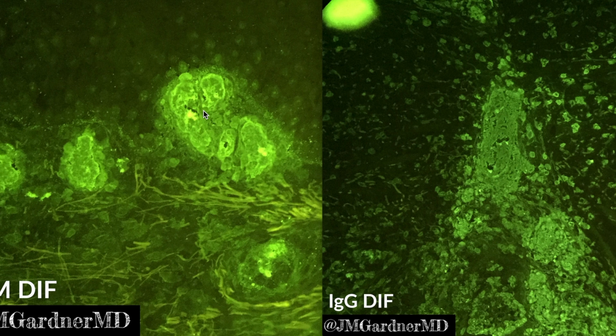But you can see the deposits in the vessel are staining here with IgG and very brightly staining with IgM. And I believe in this case the patient actually had rheumatoid factor in the blood, and so this IgM is IgM with a specificity for IgG. So IgM that's called IgM anti-IgG, that's rheumatoid factor. And so in some cases of mixed type cryoglobulinemia, the deposits actually have rheumatoid factor in them. So we had both IgG and IgM present here in the vessel spaces in this case of mixed type cryoglobulinemia, which is a really nice example of how it's supposed to work.